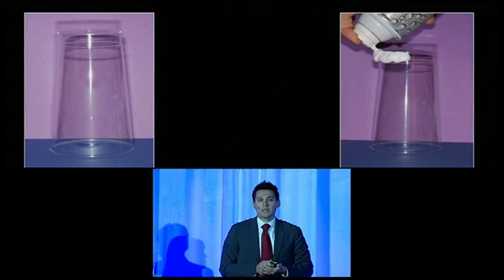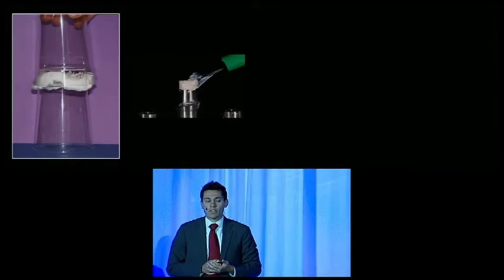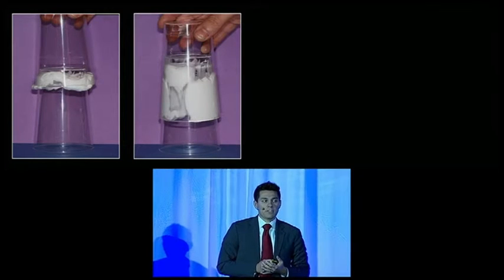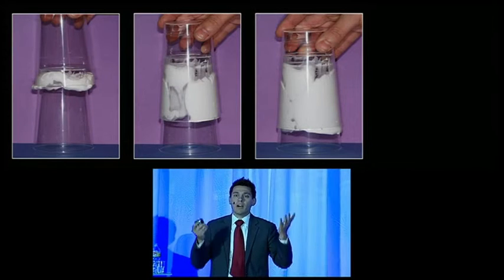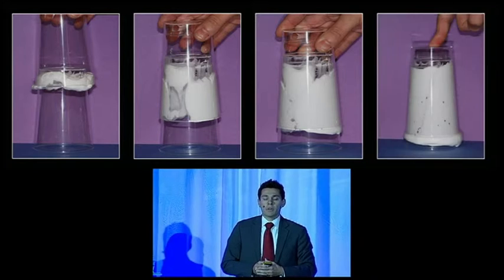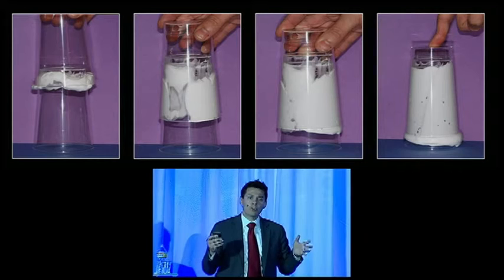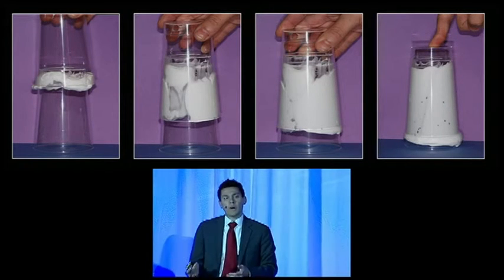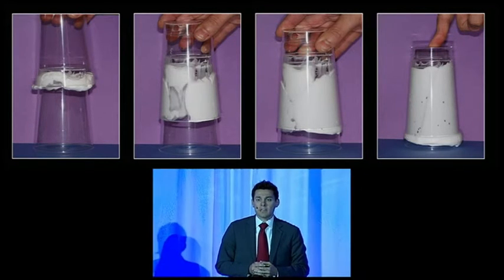This is our abutment. We place cement on top of the abutment. Now we're seating our crown. What's interesting here is the flow pattern. Look at the flow pattern of the cement. Everything is flowing down towards the gingival area. Nothing is flowing back up. So we have an incomplete fill at the occlusal, and we're also pushing with high force all that cement into the gingival area, the area where we don't want the cement to be in the first place. So this probably isn't the most ideal technique.